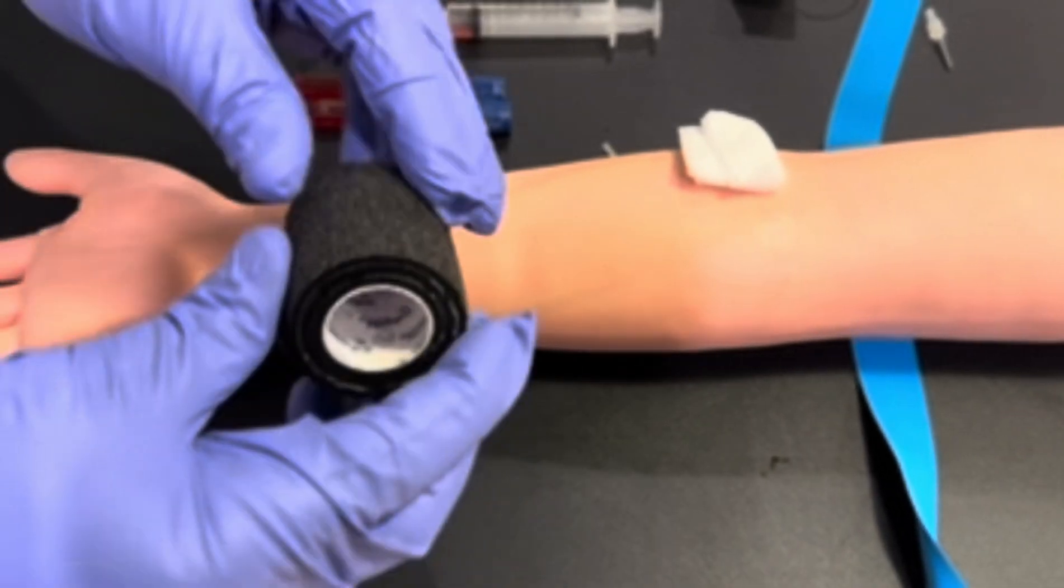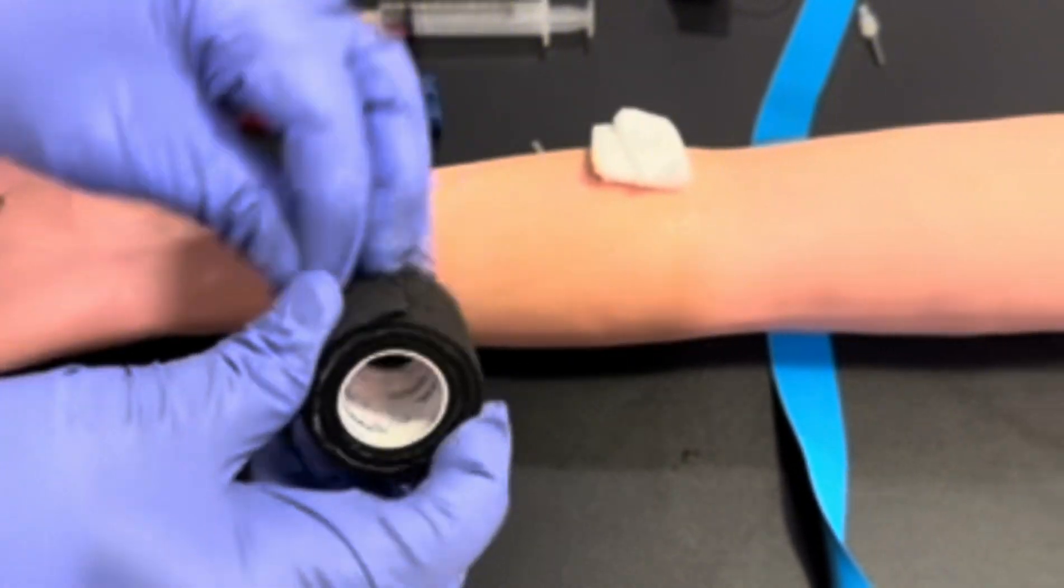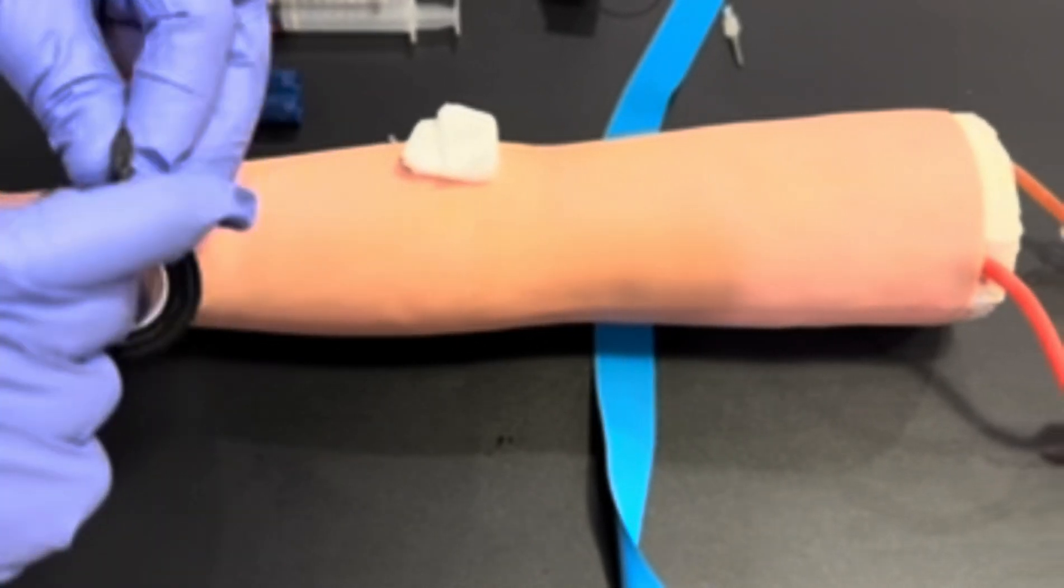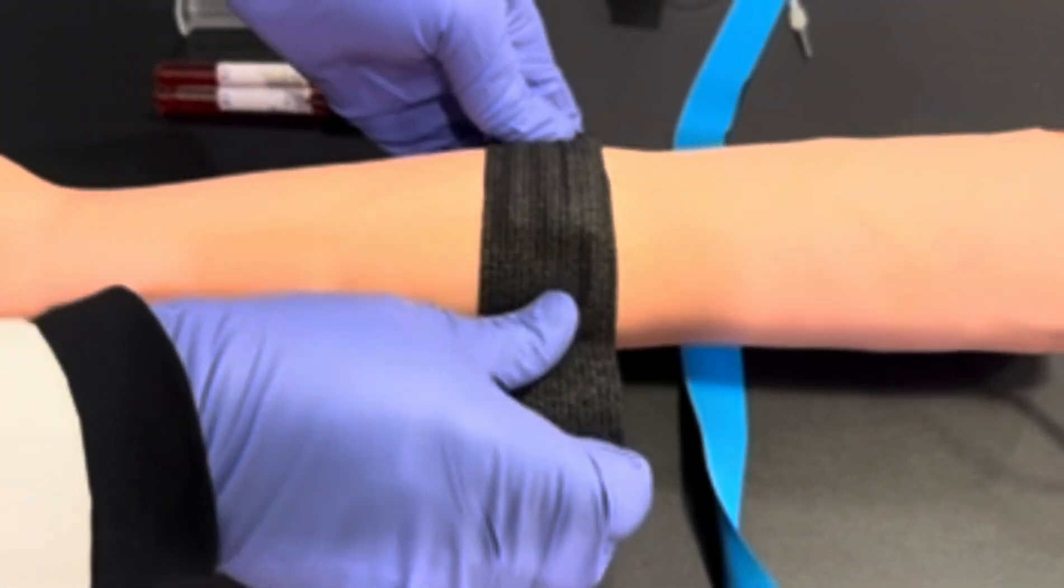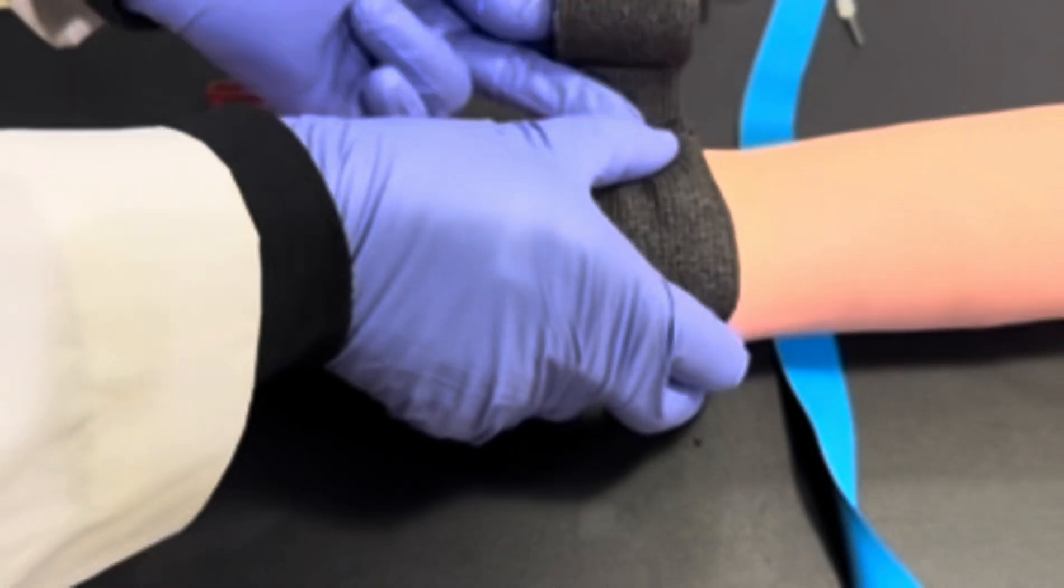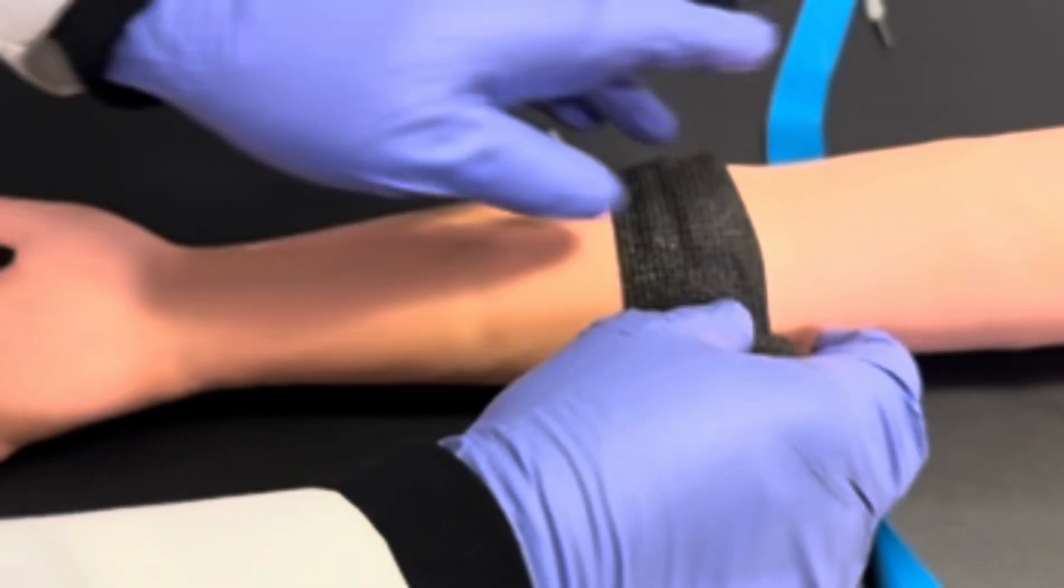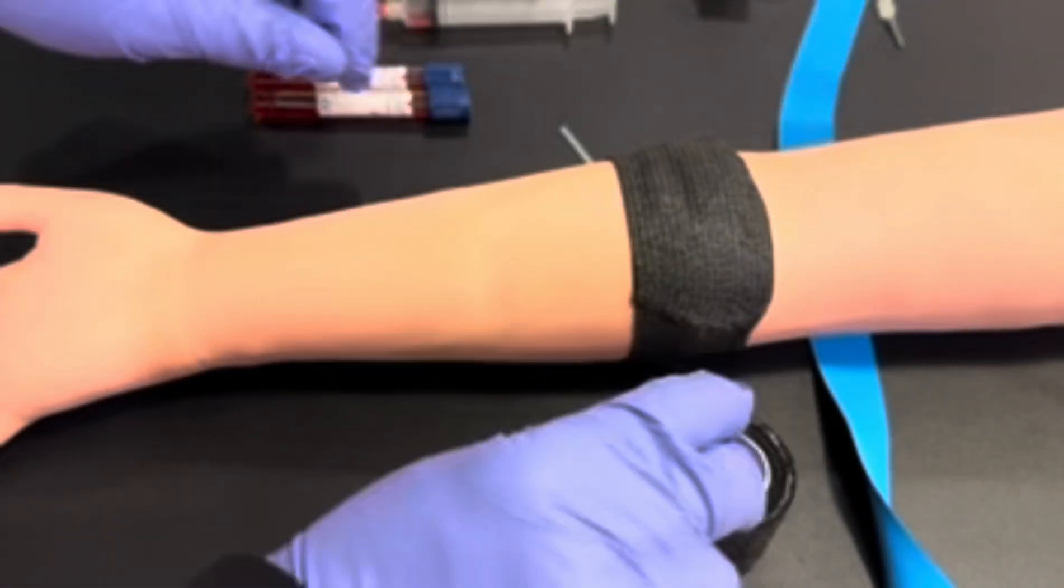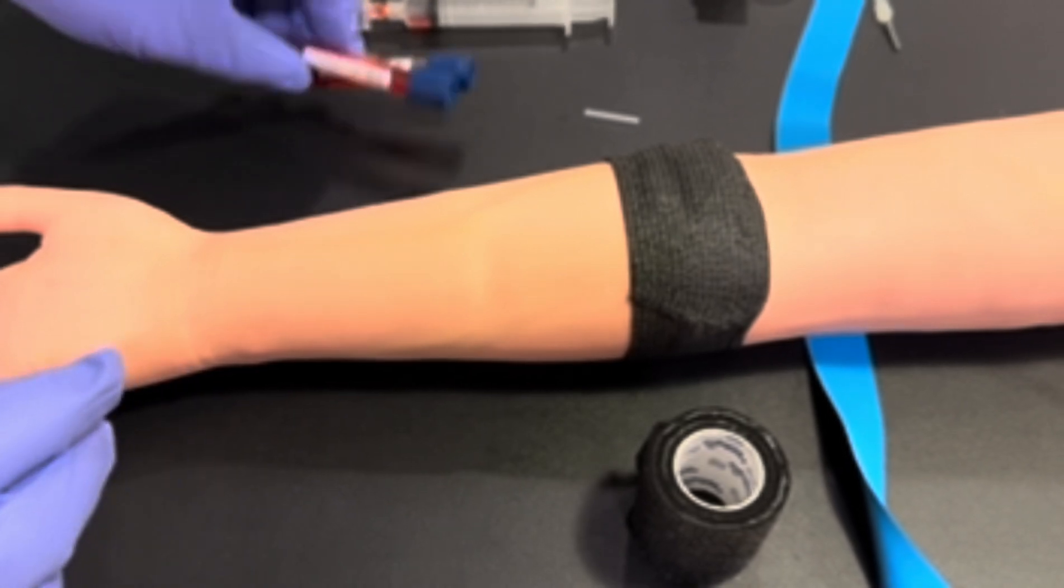Safely discard your butterfly needle after transferring the blood into each vacutainer tube. Go back to assess your patient. Apply a CoFlex bandage to the site, which will complete your venipuncture procedure.